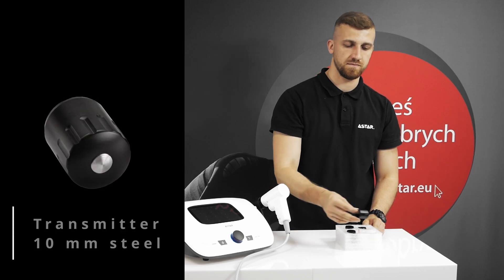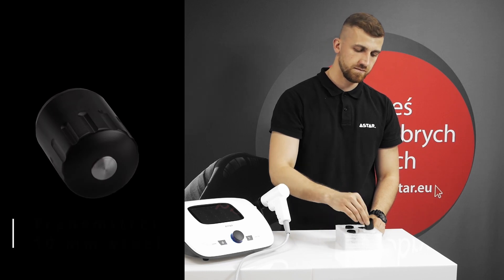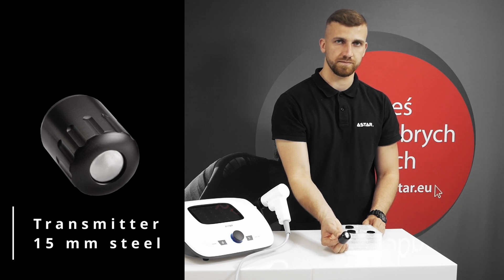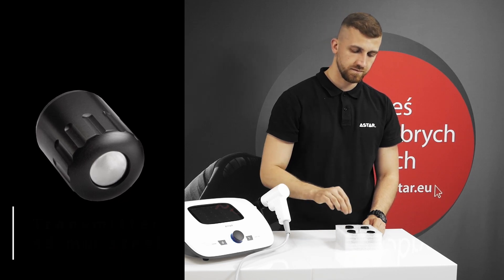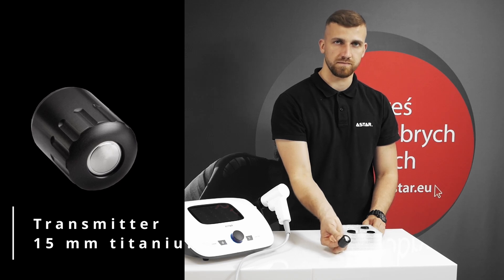The standard starter kit includes 4 transmitters. So it may happen that when the ballistic system exceeds 2 million shocks, none of the transmitters will be worn out yet. The device offers an additional option of counting the shocks for individual transmitters.